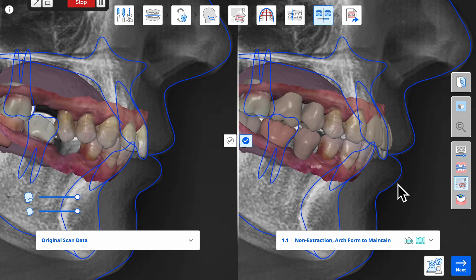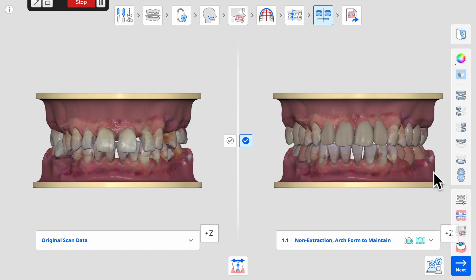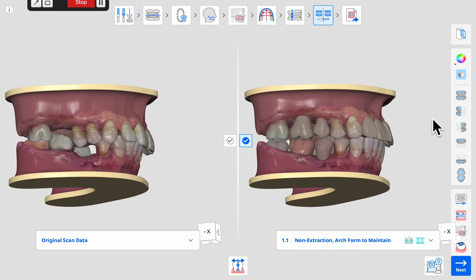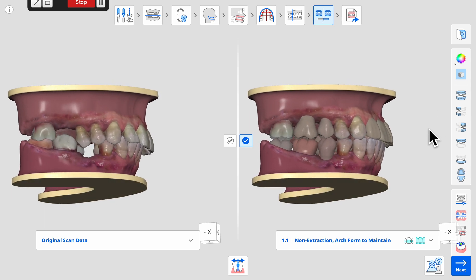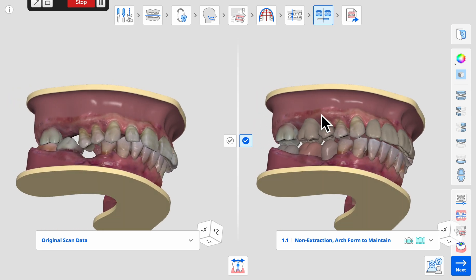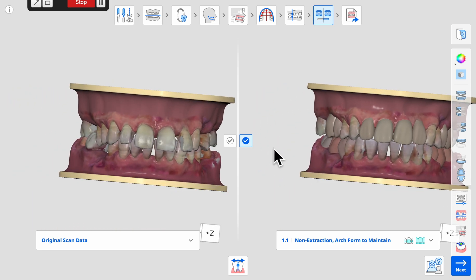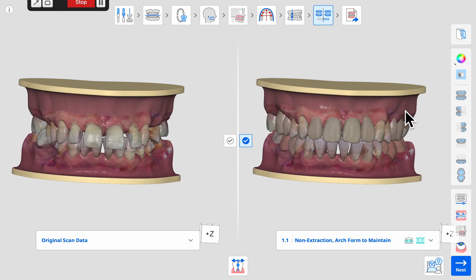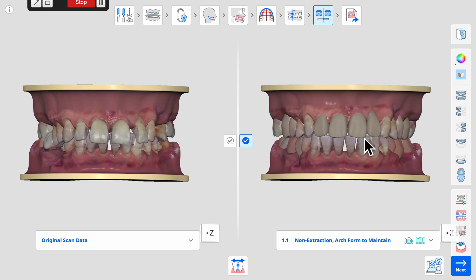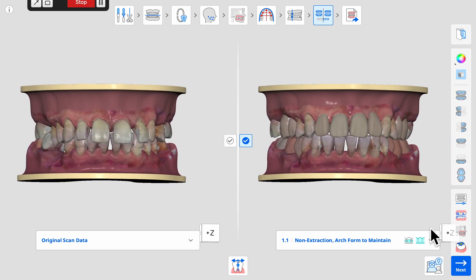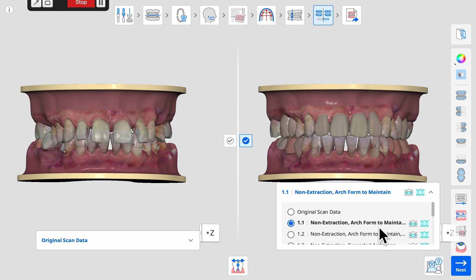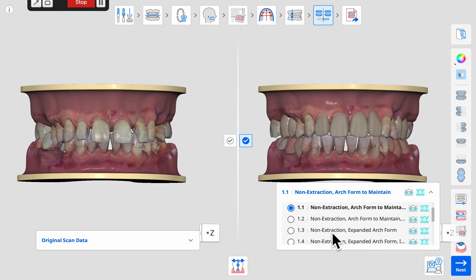If a lateral CEPH is available, each different simulation option can be viewed as an overlay on the CEPH to visualize the amount of incisor advancement or retraction in that treatment option. This helps us consider the impact the treatment would have on protrusion, lip support, and facial balance. It also represents the location of the cortical plate that would create skeletal resistance for the proposed advancement or retraction of the incisors.